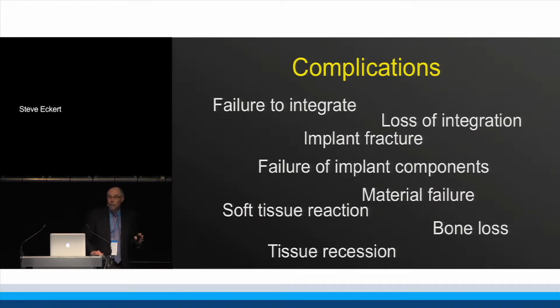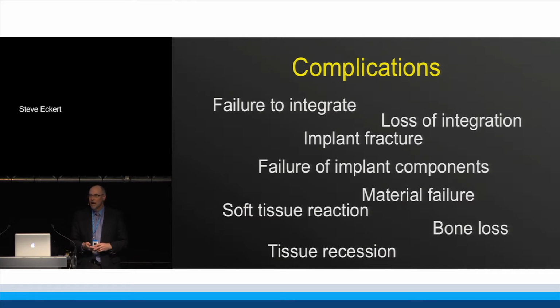Or, in my opinion, worse than failure of an implant to integrate is an implant that integrates, we make a restoration, the patient's happy, and then 6 months or a year down the line, for no apparent reason, the implant fails. That's a loss of integration. We've got some new terms that we might apply to that, but we'll get to those eventually.